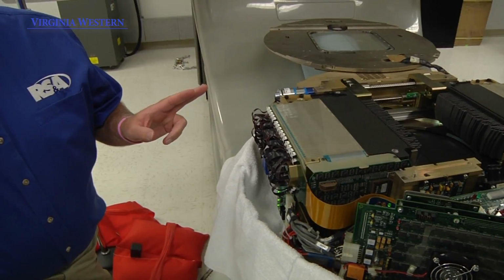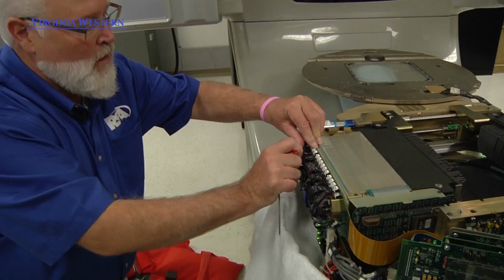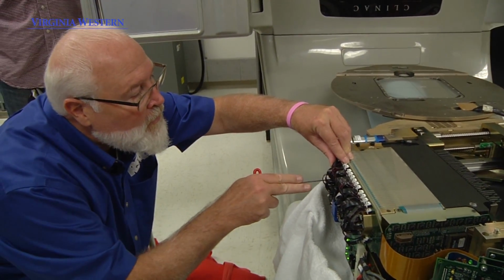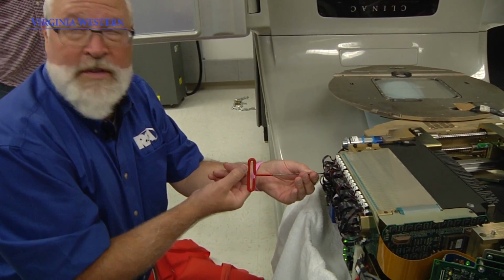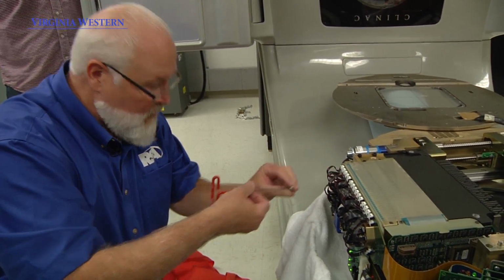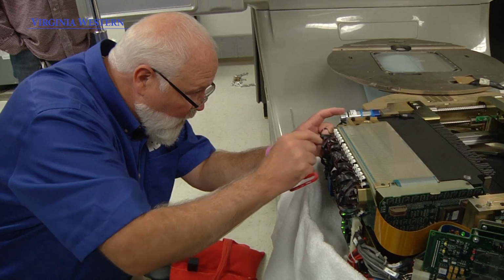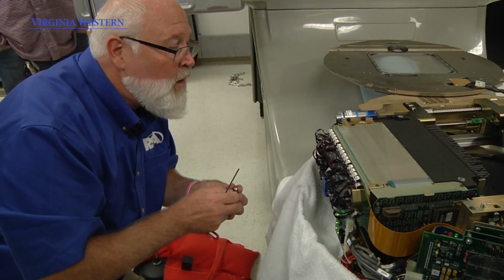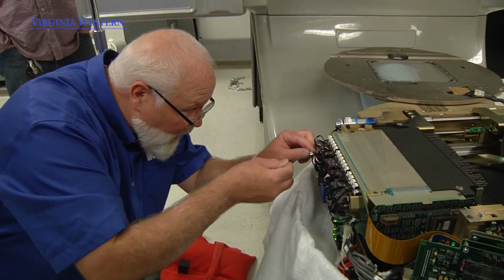Okay, so who did 58 or 59? So we can see that they're incorrect. This one is not incorrect. This one's not springy. So when you tried to tighten it down, it was tight. But the one leaf, this one, there we go, was not in properly. So it prevented you from screwing the retainer screw down all the way.